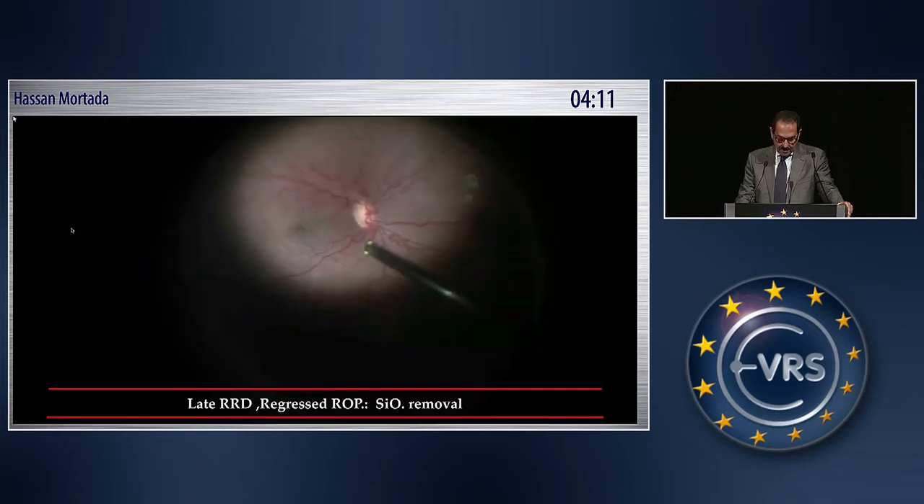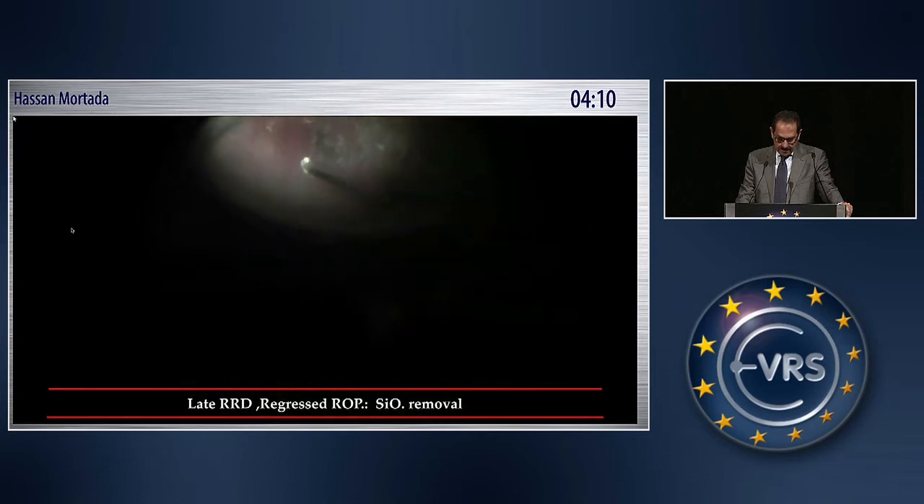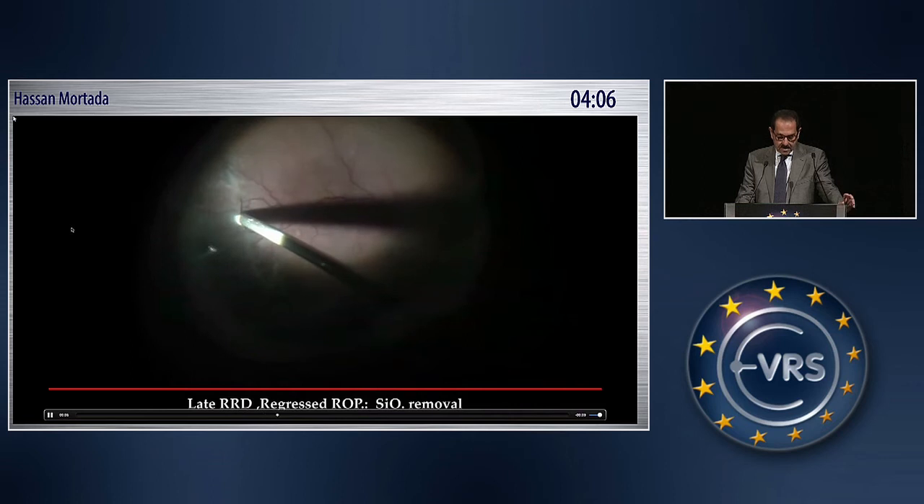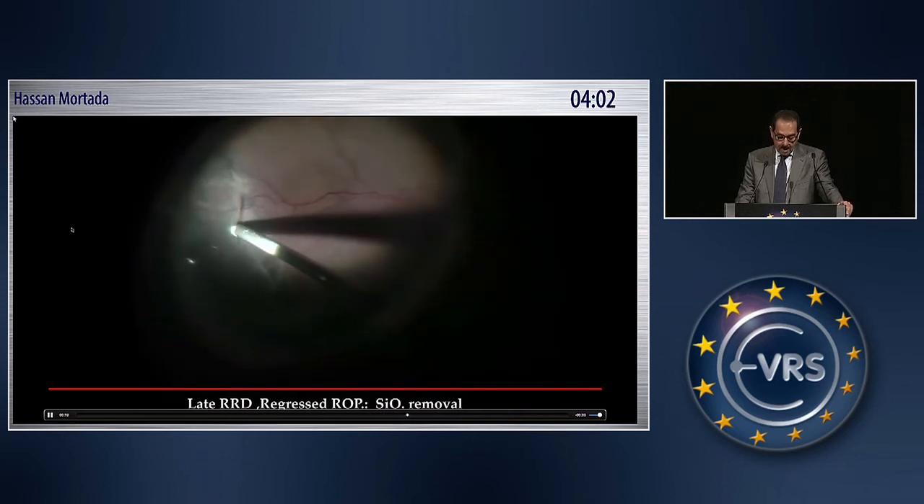This is the case at the time of silicone oil removal. The macular area is flat, with no proliferation except at the edge of the area where the ILM was removed.